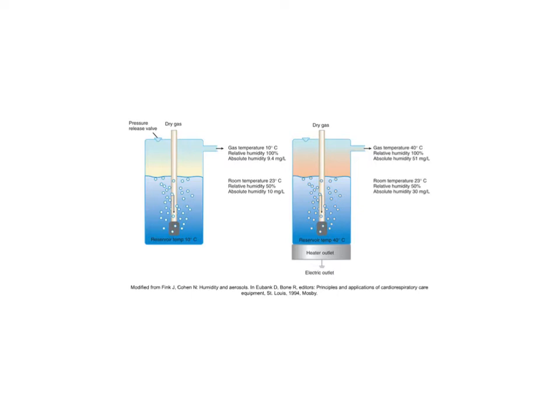Now, what happens if we heat the humidifier? So if we add heat to a humidifier, we're going to increase that absolute humidity, which is going to increase the humidity output.